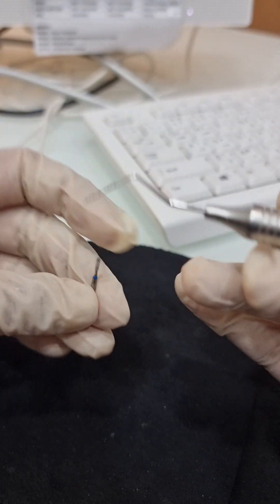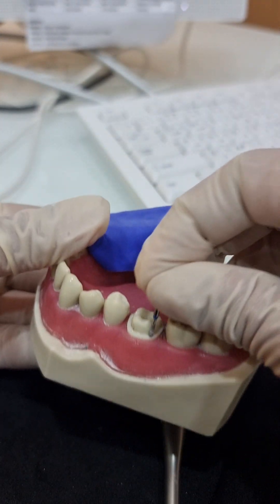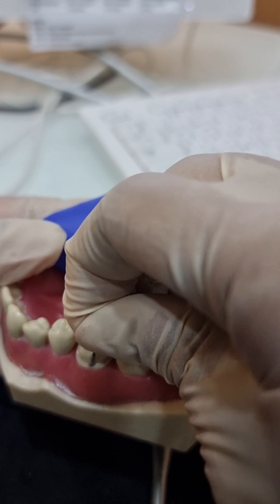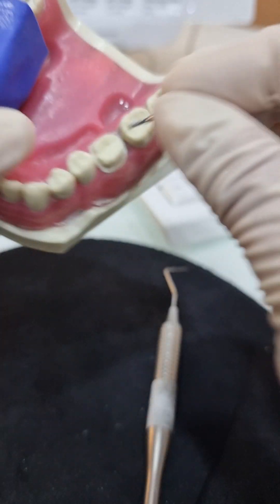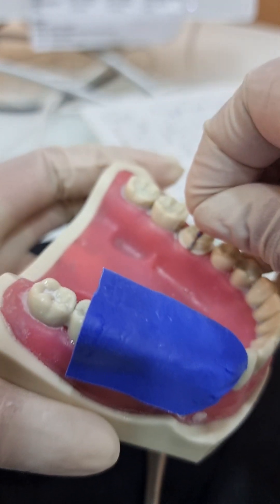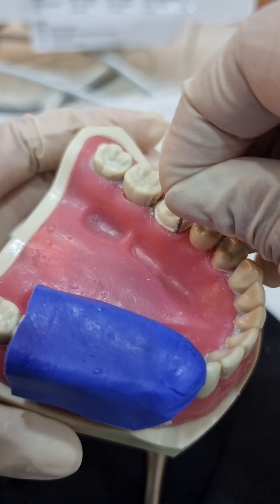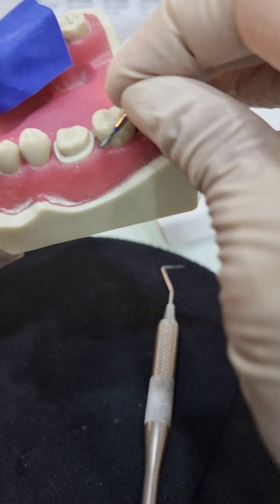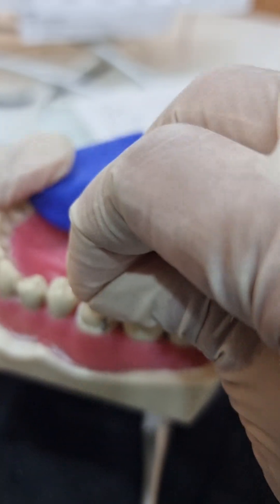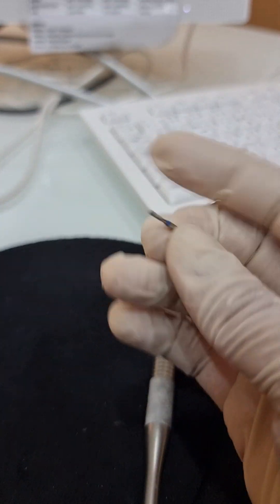When you know the diameter of the burr, you know how much you are preparing. When this burr fits nicely in your preparation, that means you have just crossed 1mm. On the lingual side, if the entire diameter of the burr does not fit - it's slipping - that means it hasn't crossed 1mm, which is what you want. On the labial side you want it to cross 1mm, so your burr should sit nicely in that area.